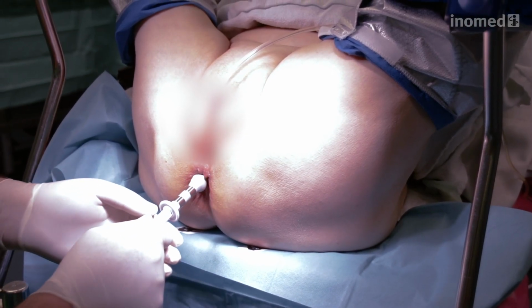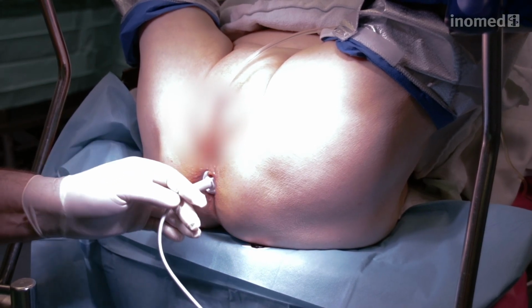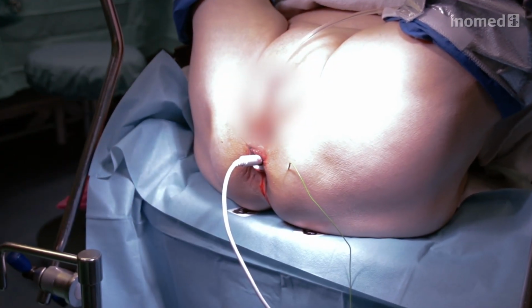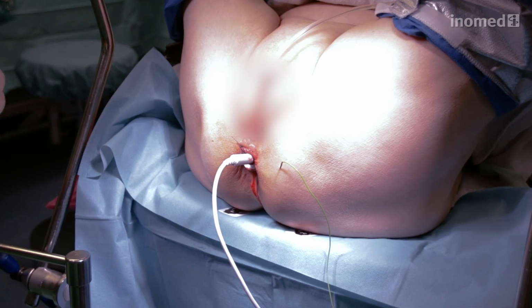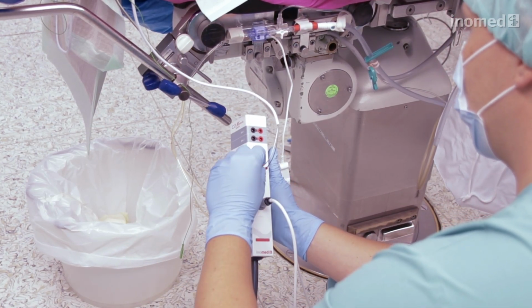The rectal electrode is inserted into the anal canal and fixed by using either tape or a suture. The green electrode can be inserted into the gluteal tissue. All parts should be attached to the patient's body in order to not slip out accidentally during the operation. Subsequently, the electrodes can be connected to the adapter box.